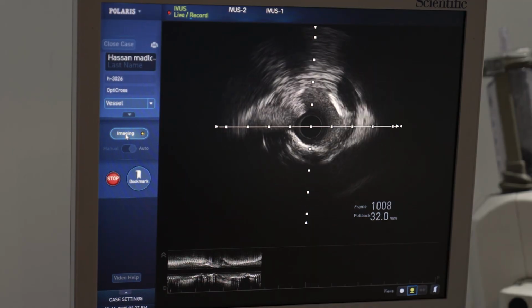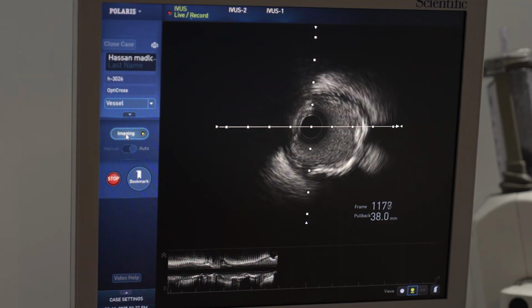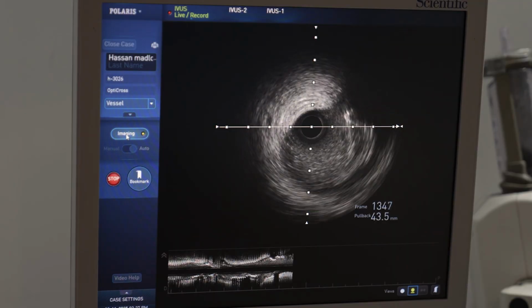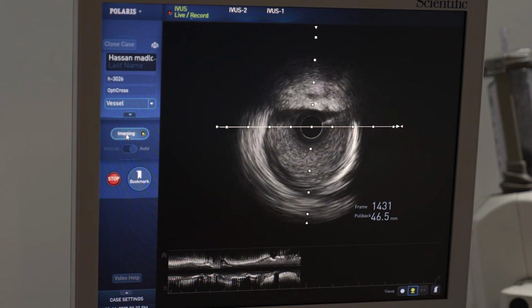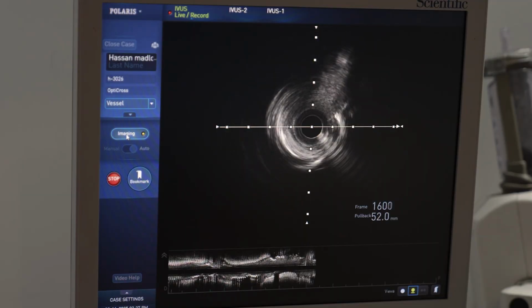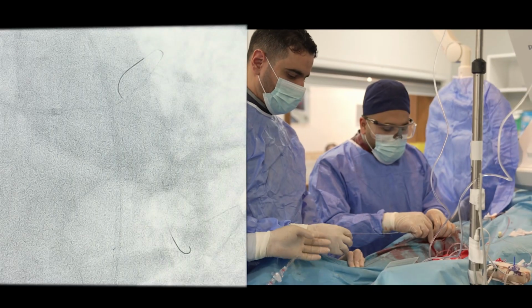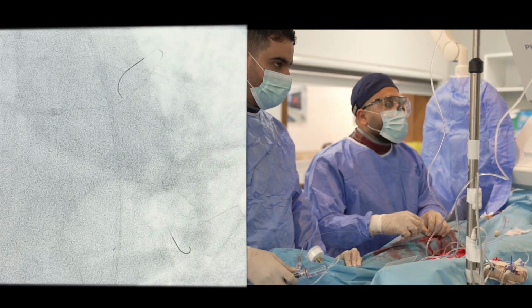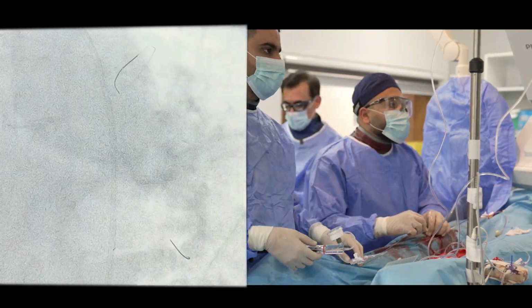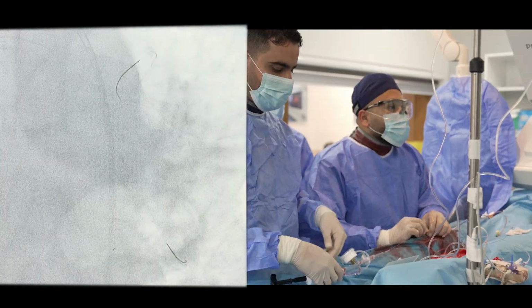Okay. The proximal part of the circ. We have some landing zone here. And this is the proximal part, I think this one, yeah. Bifurcation, left main stem. Okay, stop recording. We are going to predilate the circ, the mid part, needs some predilatation. Balloon 2.520. The proximal circ looks okay, although there is some plaque at the ostium.